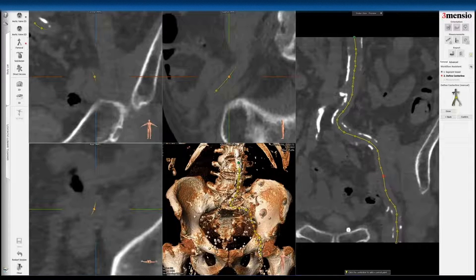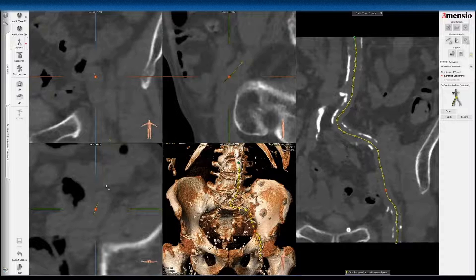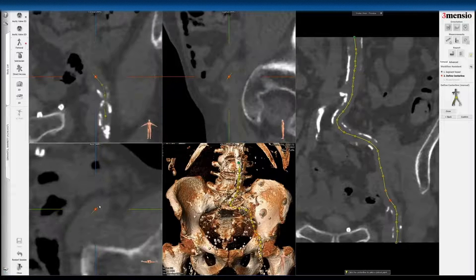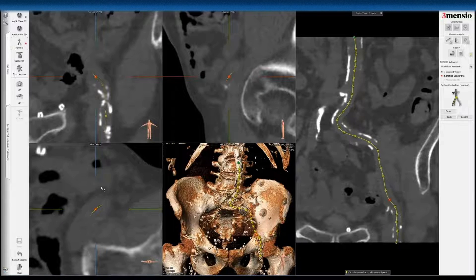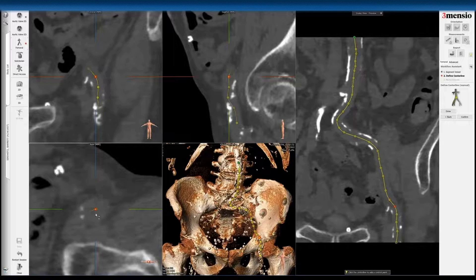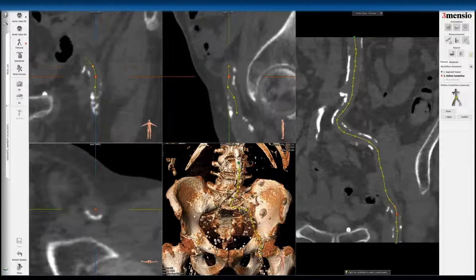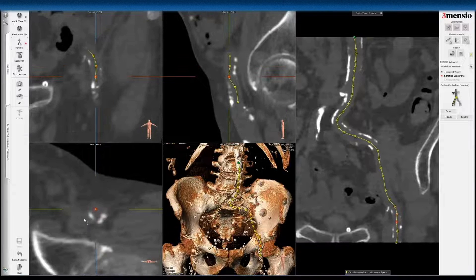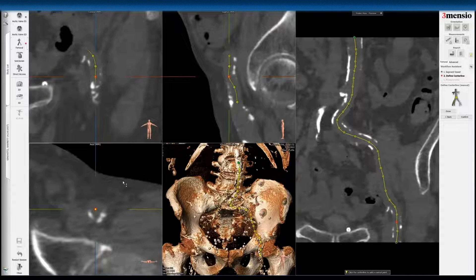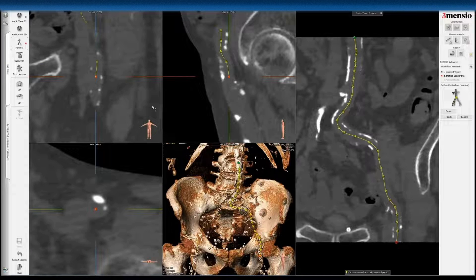So if you have the capability, you can also do a low-dose contrast CT angiogram to at least light up the access vessel — from the aortic root — to the extent you can still do a proper segmentation. But if the patient cannot have any contrast, even per your local radiology protocol, then this is still an alternative option.